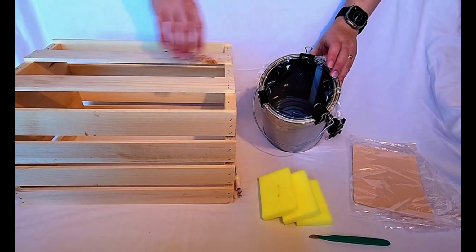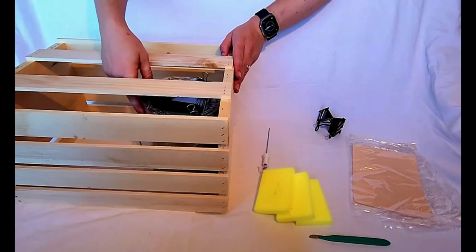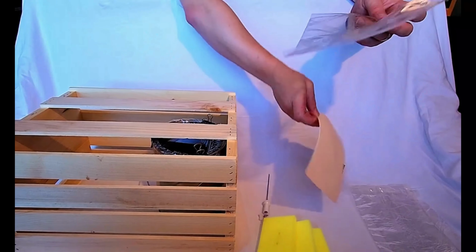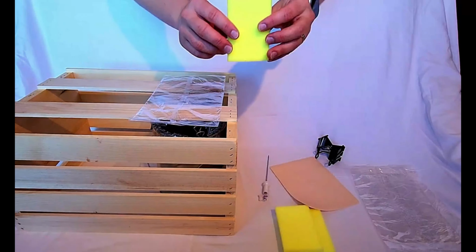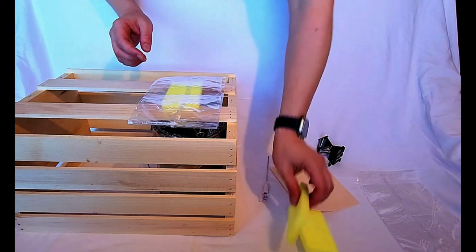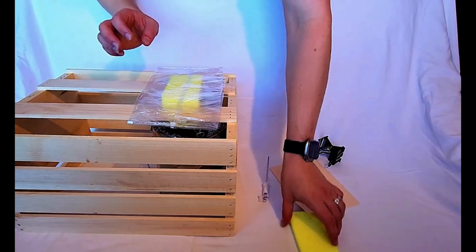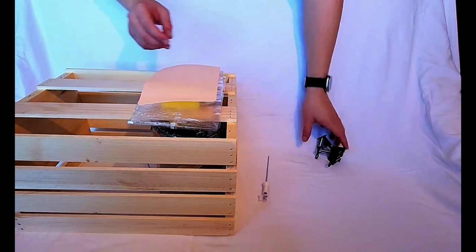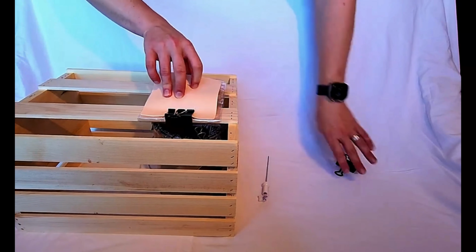We will begin building our simulation by attaching the plastic wrap to the top of the paint can with clamps to simulate underlying bowel and then place it beneath the wooden crate. Next, we will remove the tattoo skin from the packaging and place the first layer on the crate. Next, we will place a sponge, followed by another layer of packaging. We will repeat these steps until a total of 3 sponges and 3 plastic packages are on the wooden crate. Lastly, we will place the tattoo skin on the top and clamp the layers down to the crate with clamps.